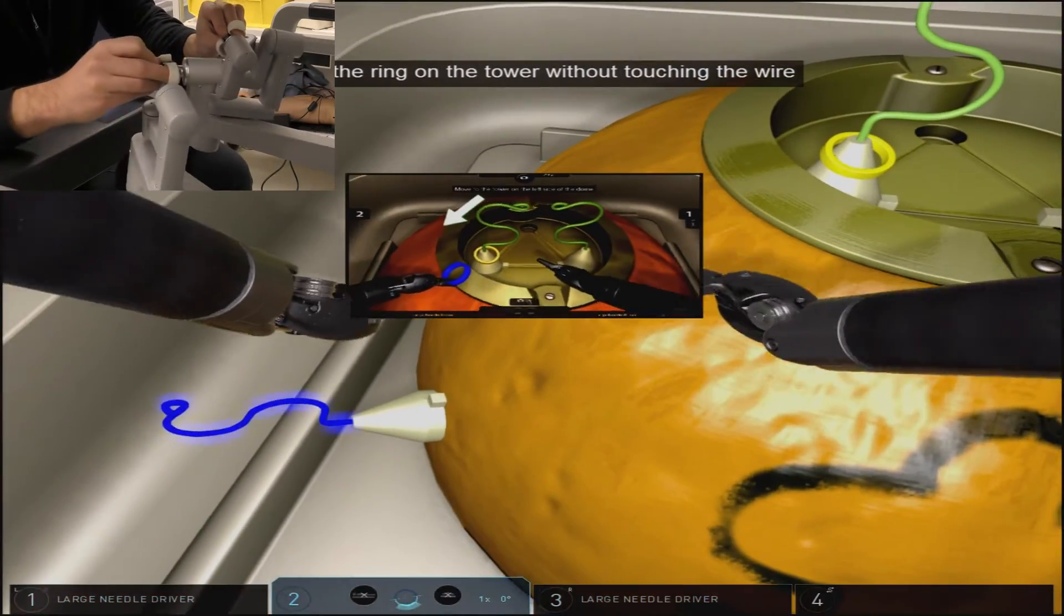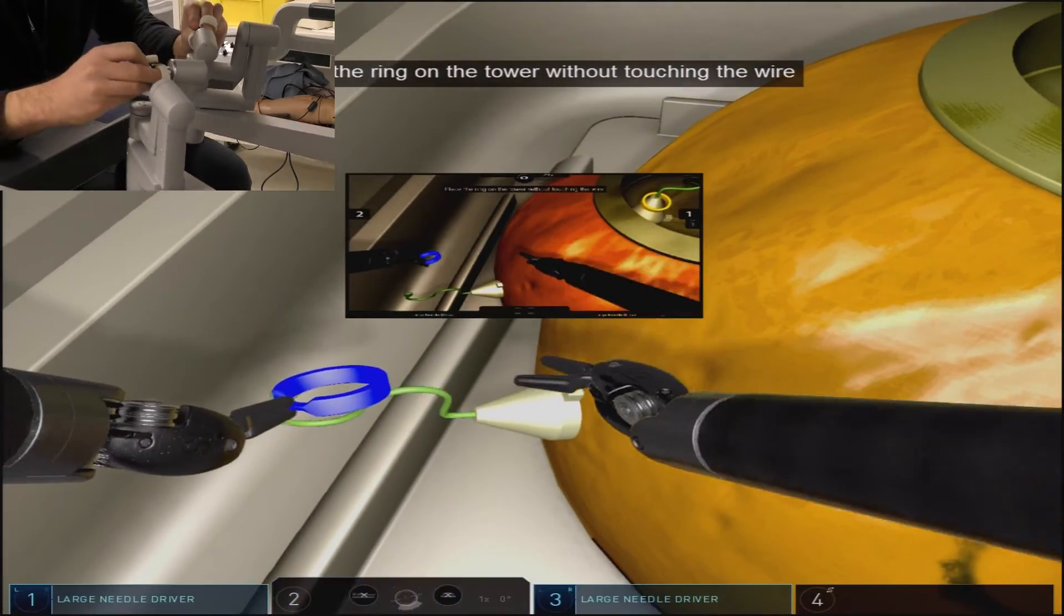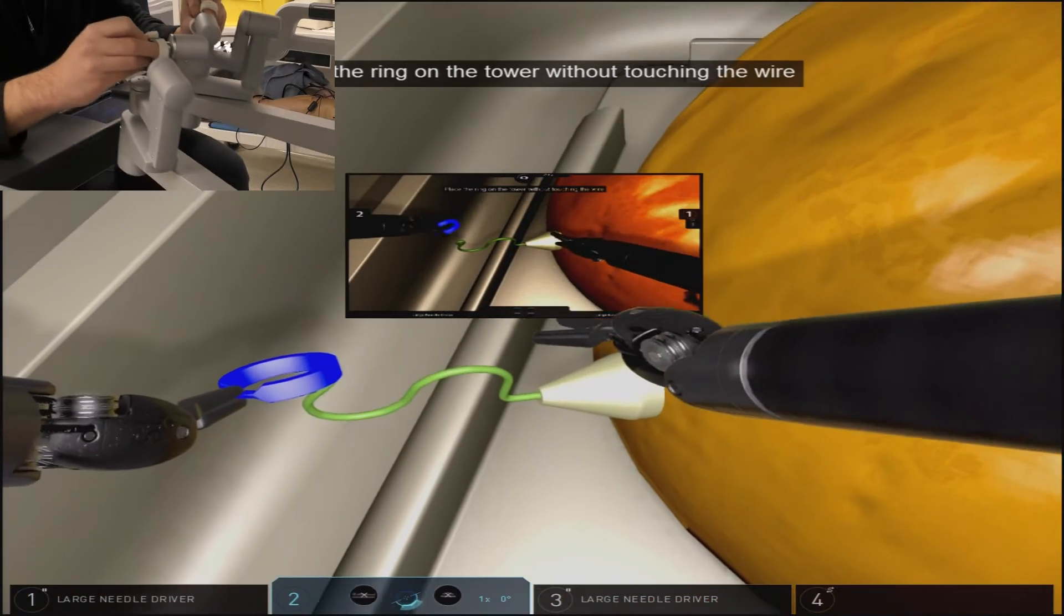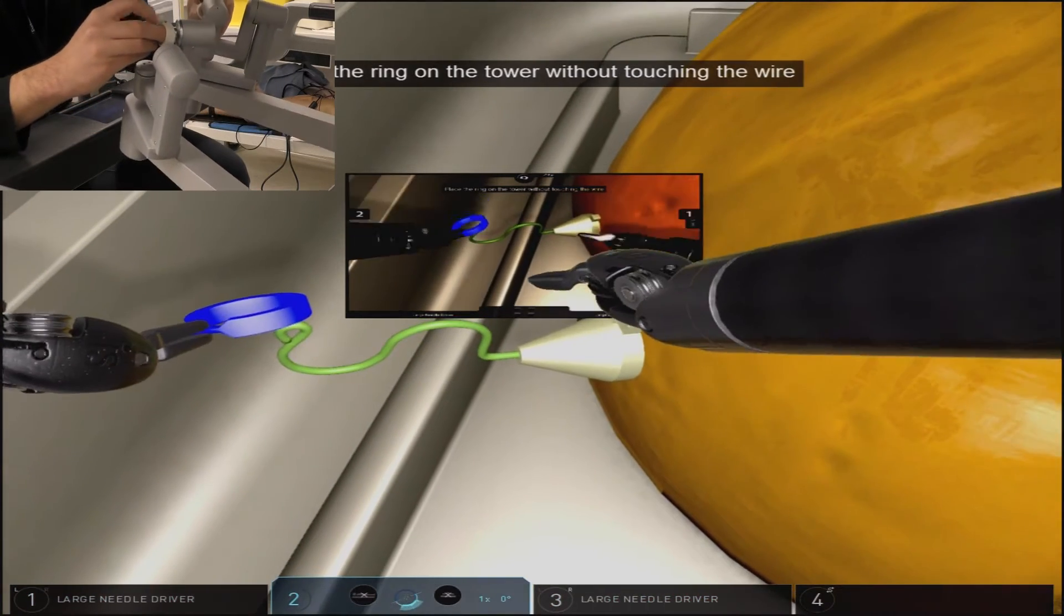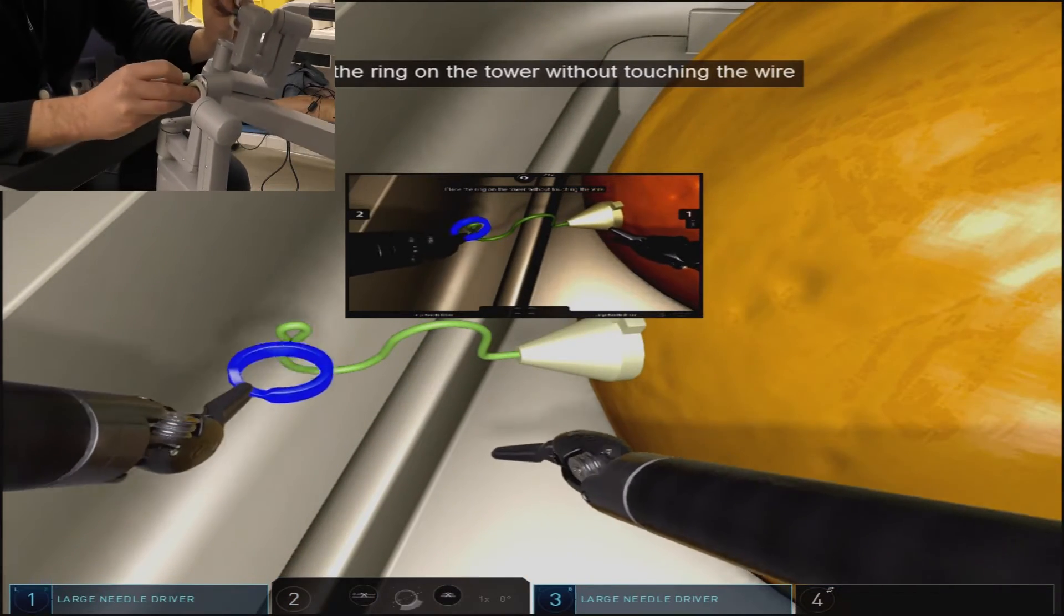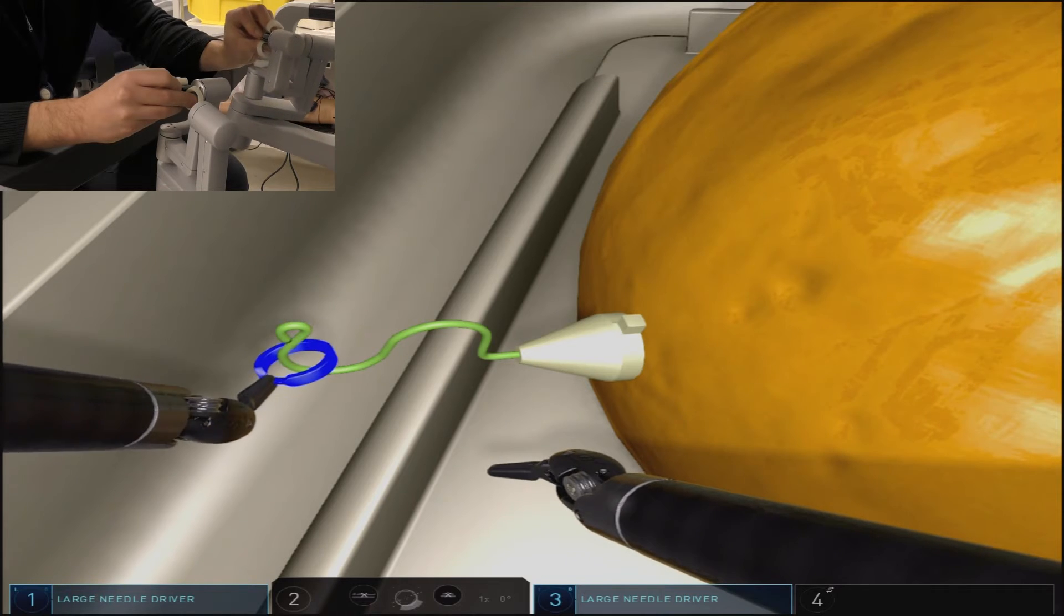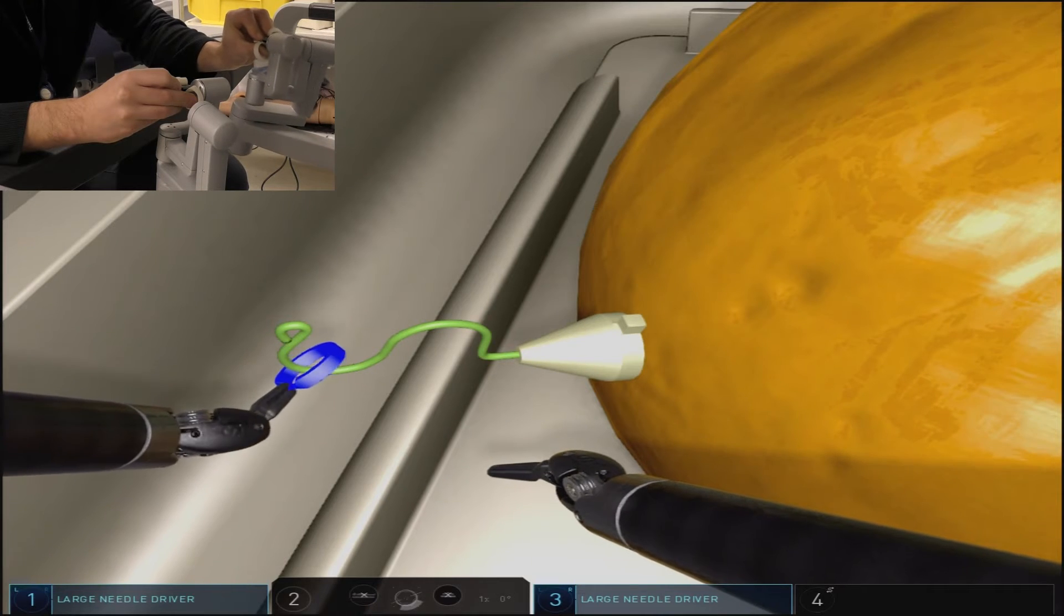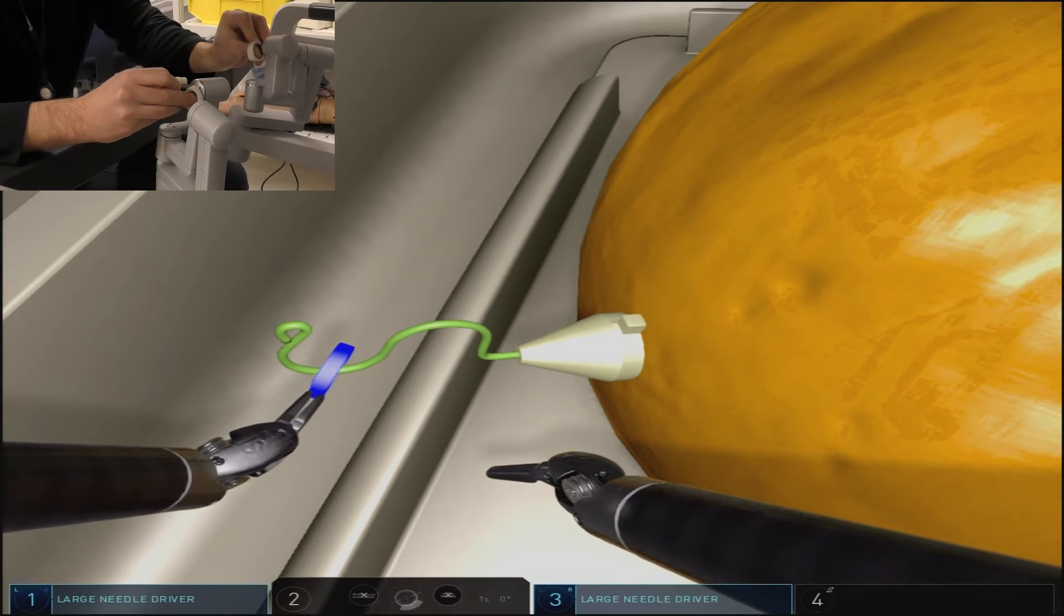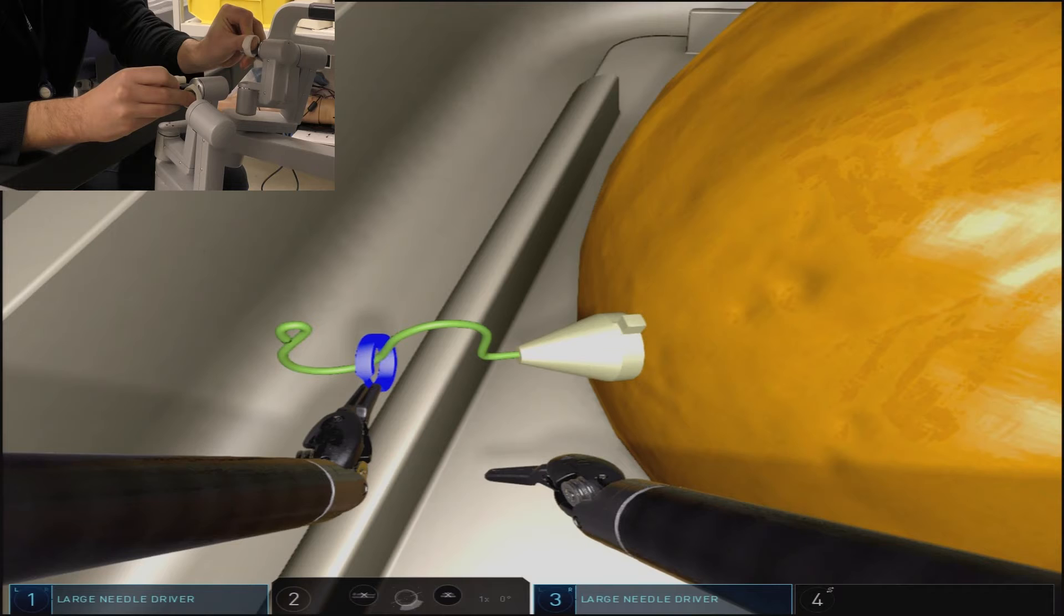Once you successfully have removed the ring from that wire structure, you will pass it off to the other hand and then navigate towards screen left where you will have to place this ring at the base of another wire structure.